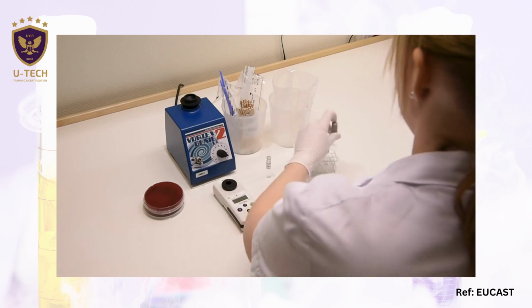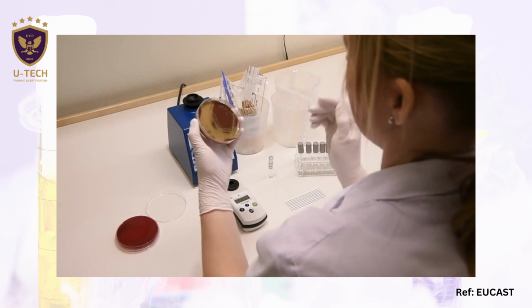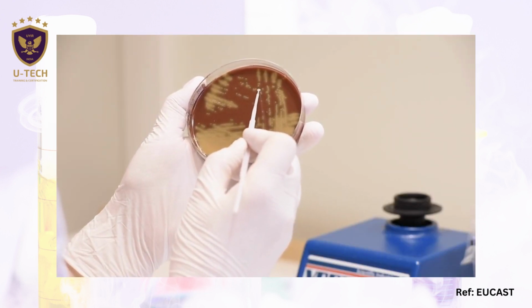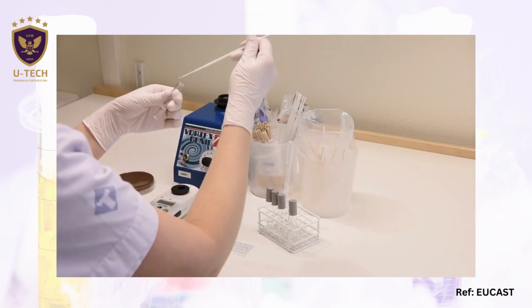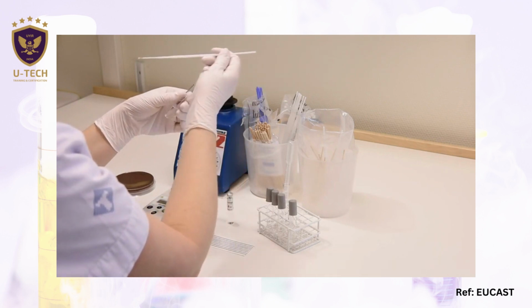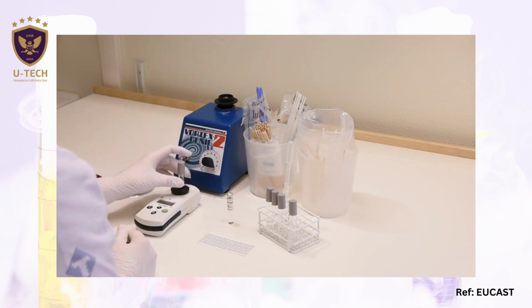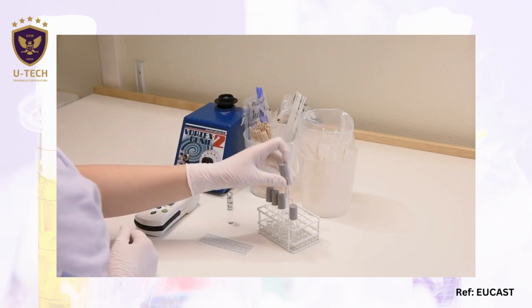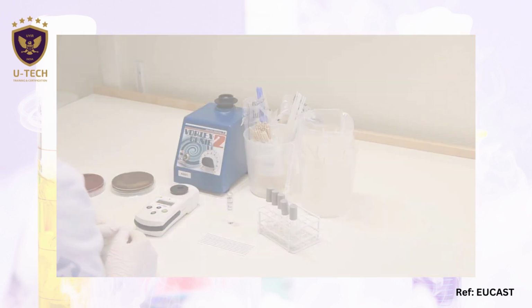If Streptococcus pneumoniae is suspended from a chocolate agar plate and not a blood agar plate, the inoculum must be equivalent to a McFarland 1 turbidity standard. Use the adjusted inoculum suspension optimally within 15 minutes of preparation and always within 60 minutes of preparation.